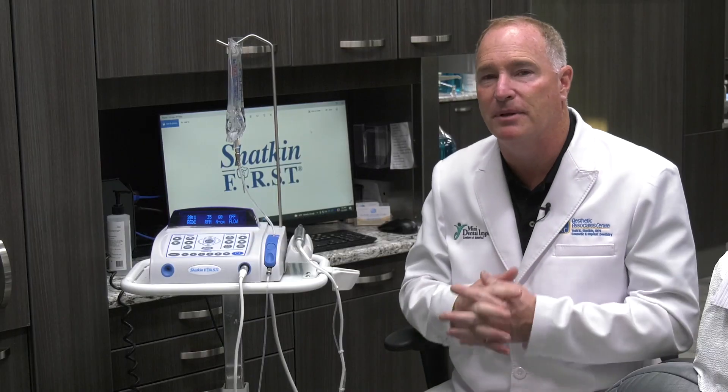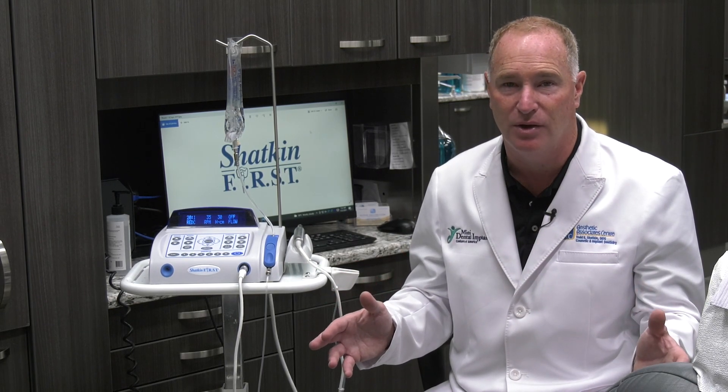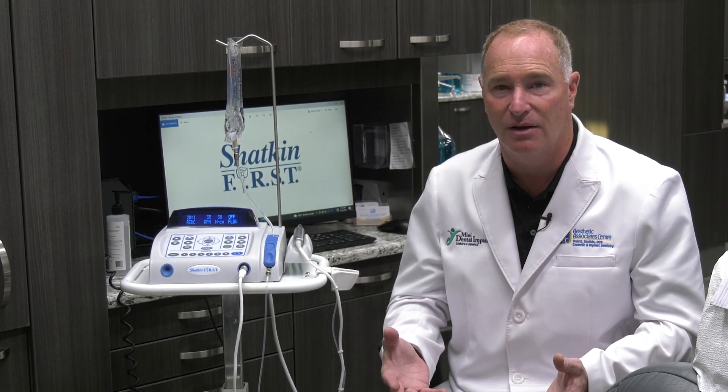Now what happens if you don't get to 30 newton centimeters of torque on your initial torque test? If you have multiple implants — say you're doing 8 to 10 implants for a roundhouse and 9 out of 10 get to 30 newton centimeters but one doesn't — I'm not too worried about that, because the other ones will take up the slack and you can still load that restoration.